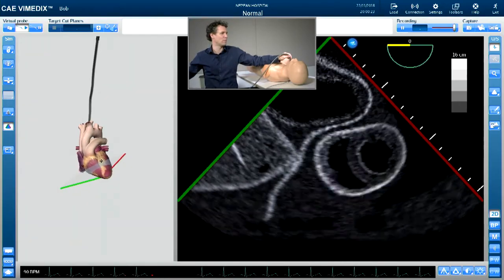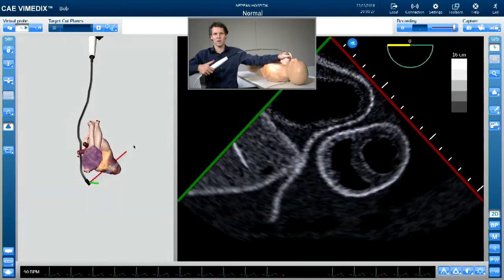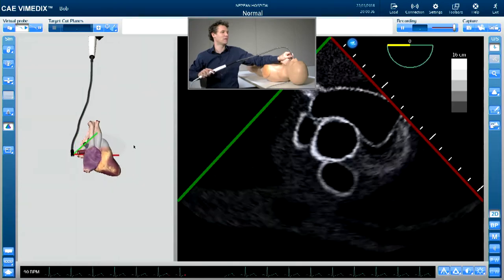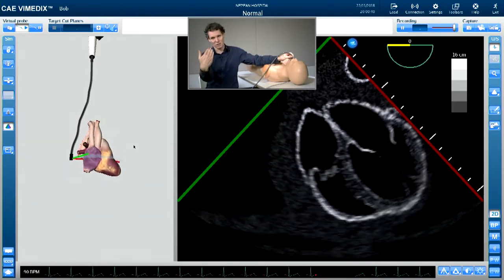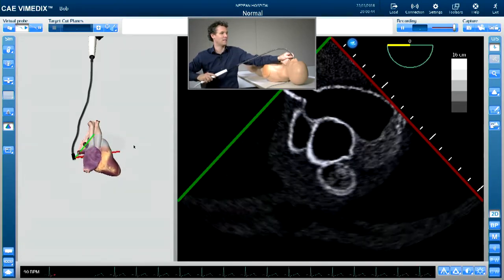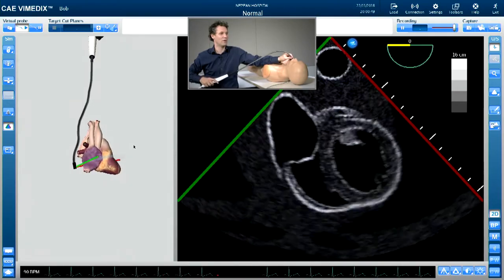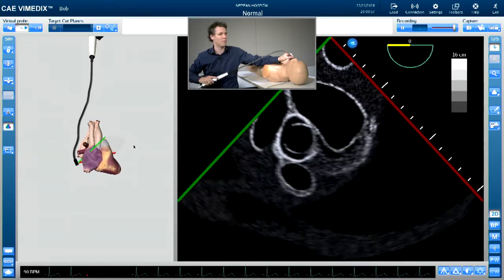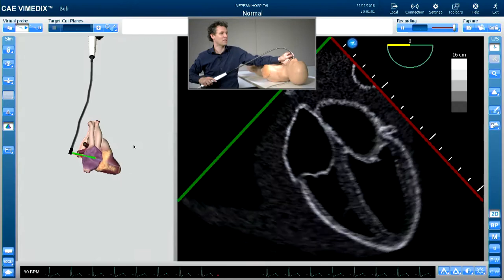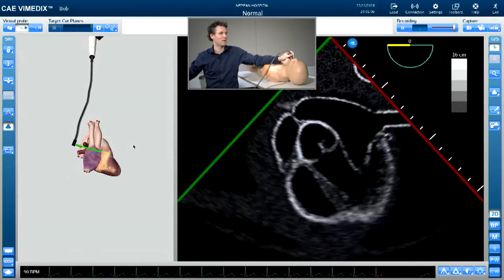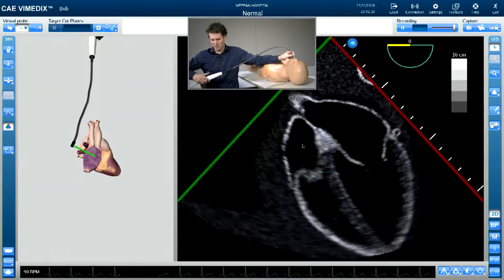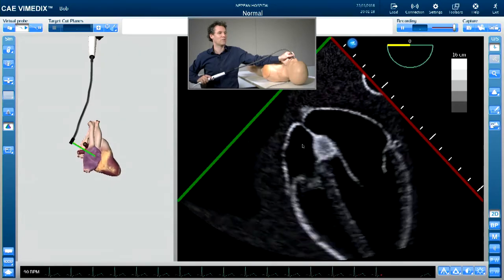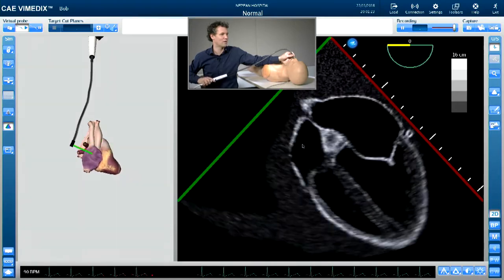Now the wheel movements. Antiflexion is curving towards the probe — like your hand coming towards you. If I'm looking at the left and right ventricle off-axis and I do full antiflexion, in comes the aortic valve, which sits a bit higher than my original angle of interrogation. Retroflexion is pushing that wheel away — you lose the aortic valve but gain a nice mid-esophageal four-chamber view.